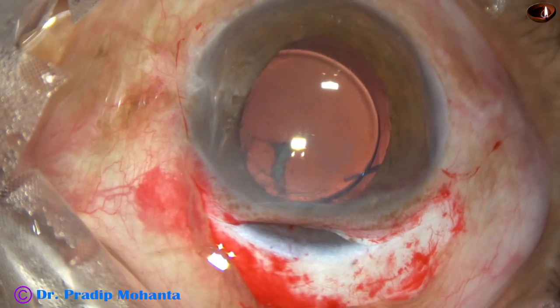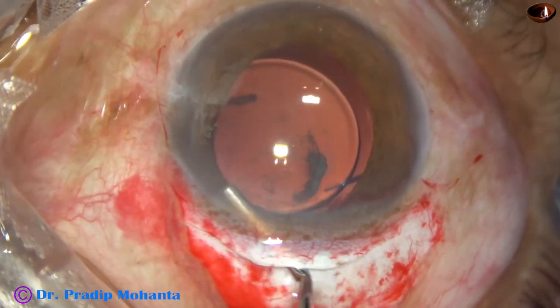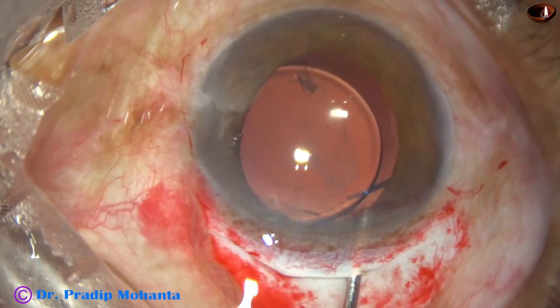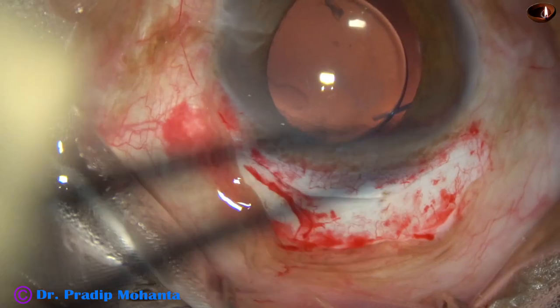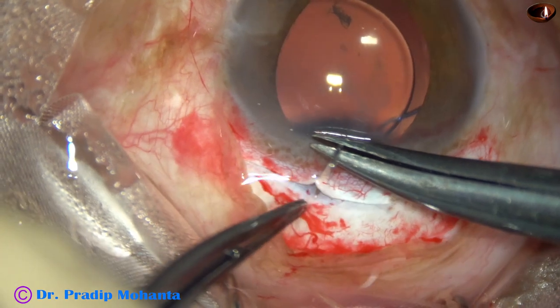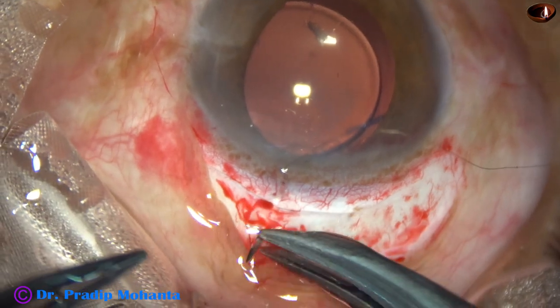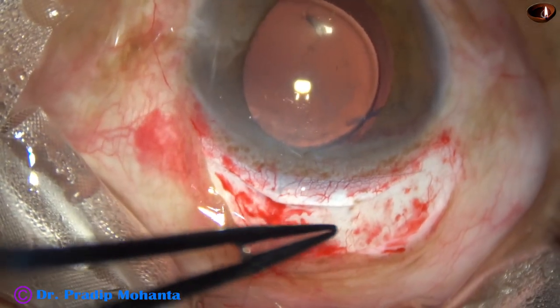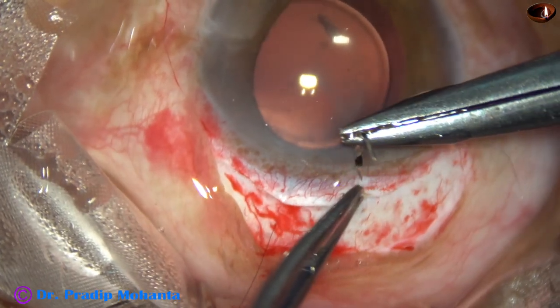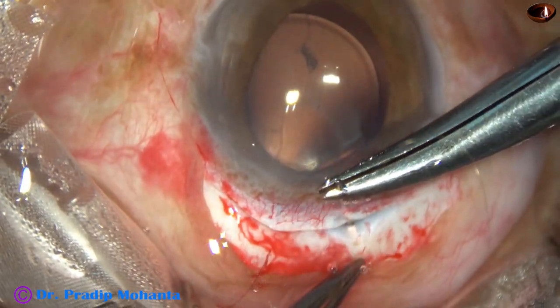There was some cortex at 1 o'clock. It has got dislodged, and now it comes out. And now two interrupted sutures are being placed to close this wound. Only two sutures. One here and the other one here, on either side of the straight portion of the wound.